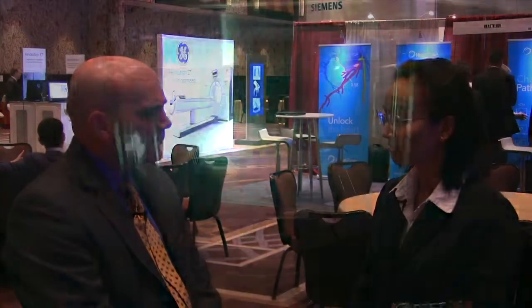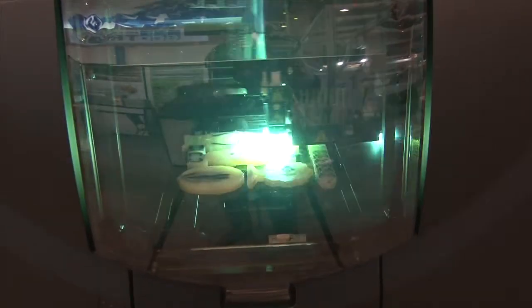From a technical standpoint, what software do you use, and what type of printer do you use to make your models? There is no one system that we can use right now. What happens is patients come in for an outpatient traditional CT scan, and when they have that CT scan done, we post-process the images. When we find the techniques that we want and the area of interest, then we make a modification and 3D print it.